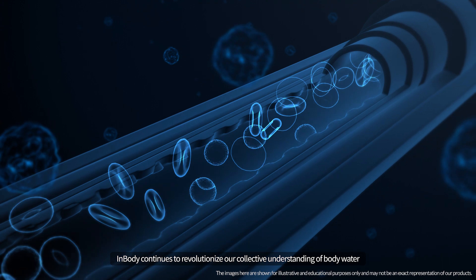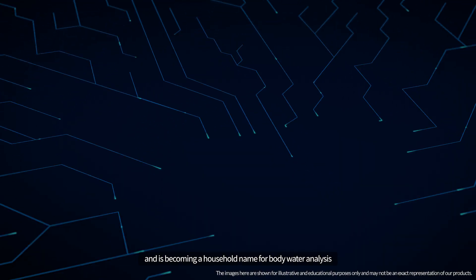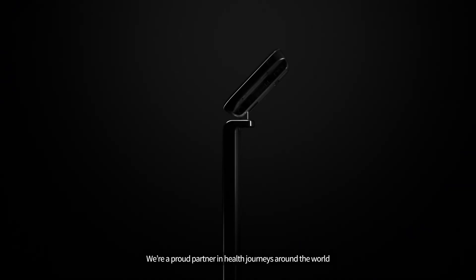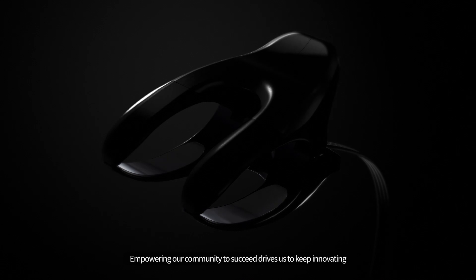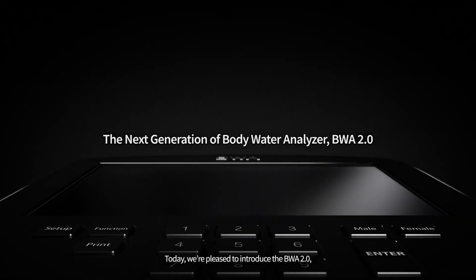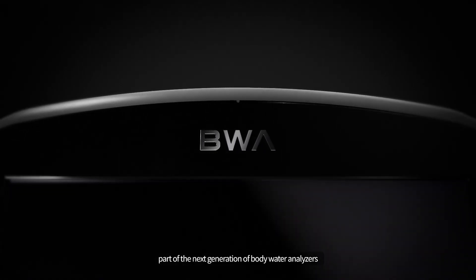InBody continues to revolutionize our collective understanding of body water and is becoming a household name for body water analysis. We are a proud partner in health journeys around the world, and empowering our community to succeed drives us to keep innovating. Today, we're pleased to introduce the BWA 2.0, part of the next generation of body water analyzers.